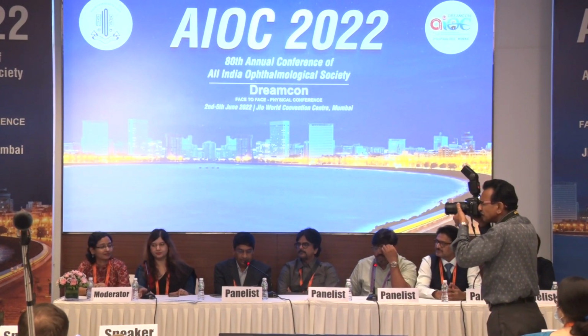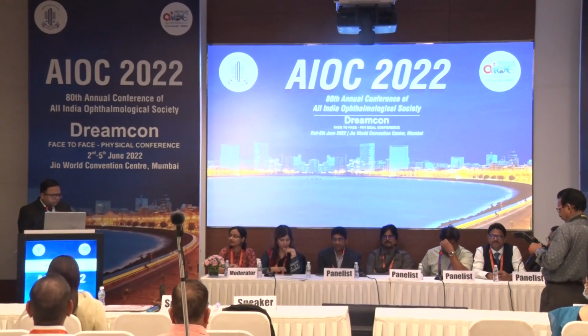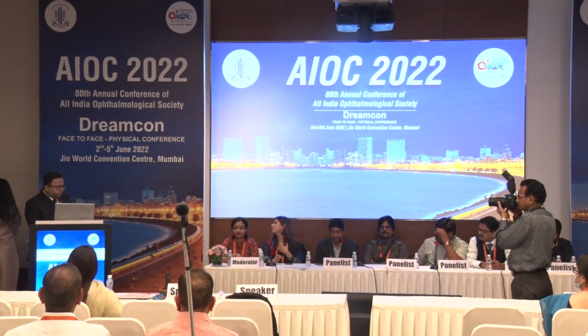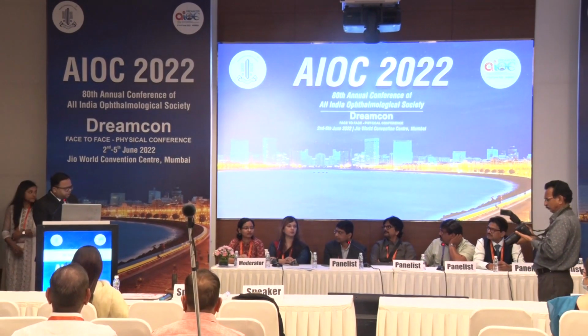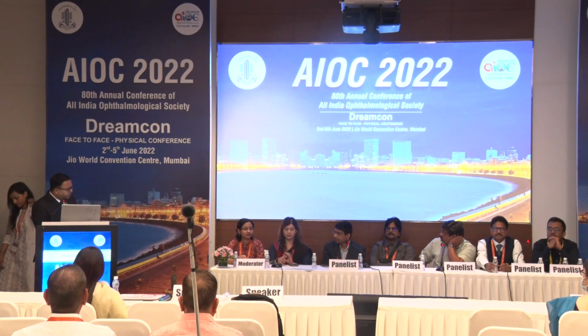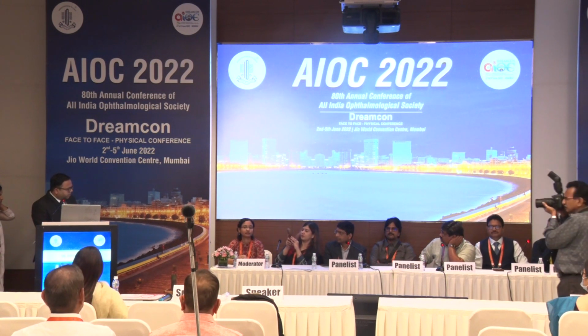Yeah, well done, Deepak. Thank you, sir. Let me know why you opted for the subretinal surgery. In this case, the hemorrhage was very thick. It was long-standing, 15 days had passed from the presentation, and it was a massive subretinal hematoma. Without subretinal surgery, it would not have helped much for the patient.